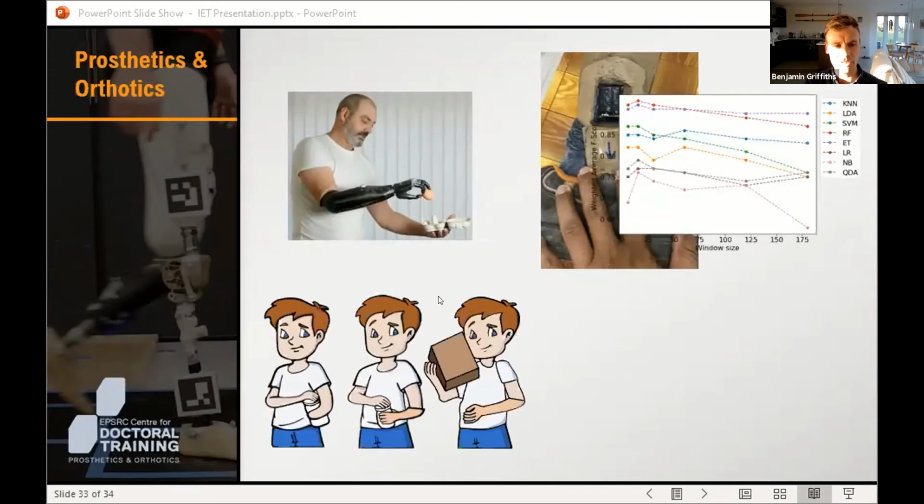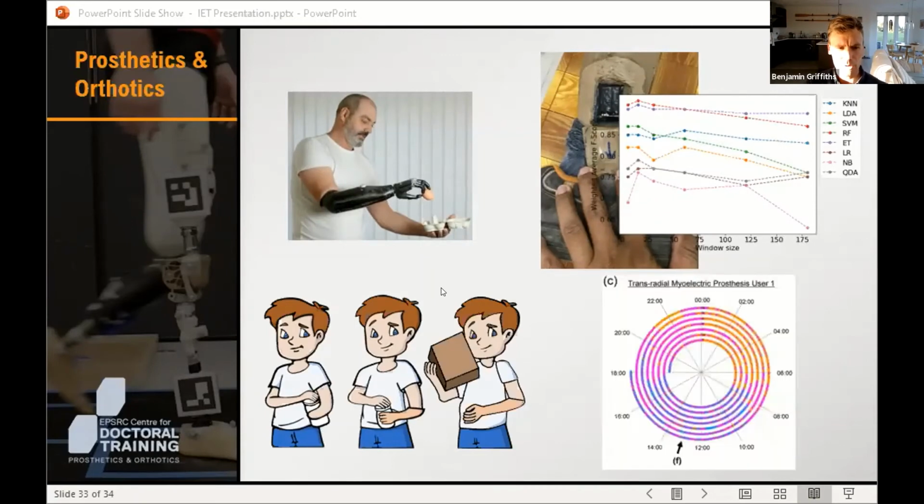Also, research is starting to emerge on what users can achieve with these devices and ultimately how they use them and how they impact their lives. However, for this to become common clinical practice, we need to understand the important outcome measures we can use to understand usage and develop systems that feed this information to clinicians so that ultimately they make better and more informed decisions.